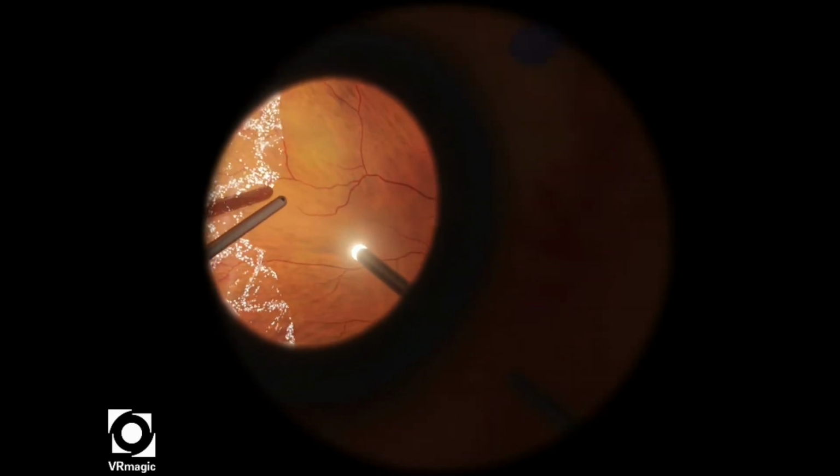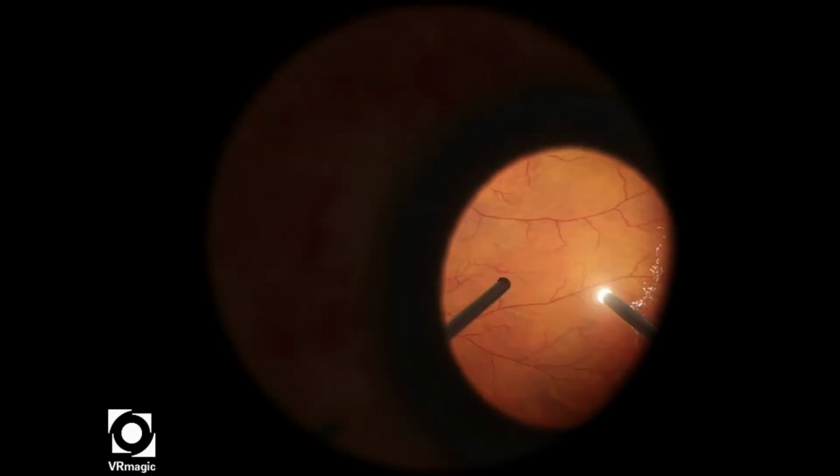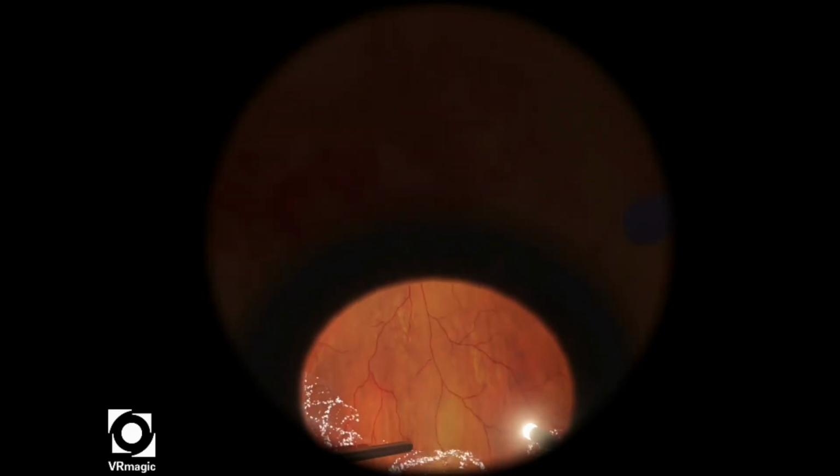So here I'm using a very high cut rate, I think the highest cut rate possible on the VR Magic simulator, and then a very low aspiration rate, somewhere between 30 and 40.